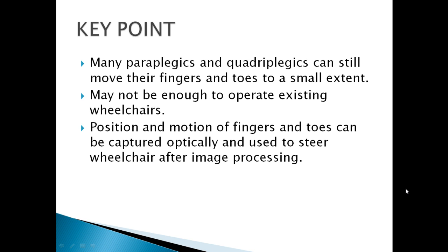So in many of the patients, this movement may not be enough to operate existing wheelchairs, but if we were to use an optical method to capture the position and motion of fingers and toes, we could use that to control a wheelchair using image processing techniques, and that is the key idea behind this project.